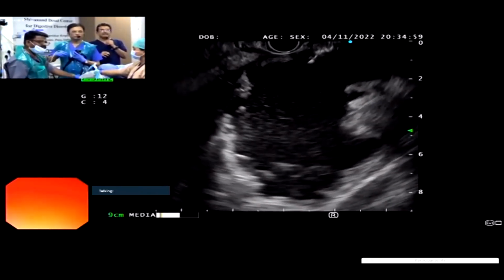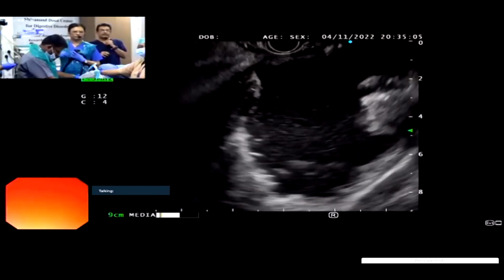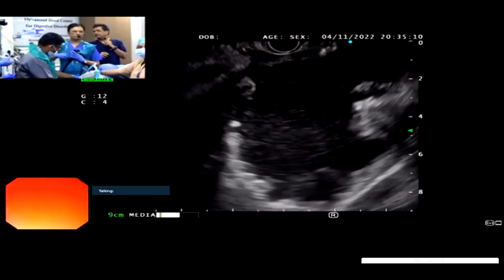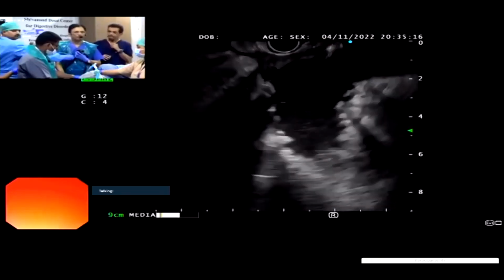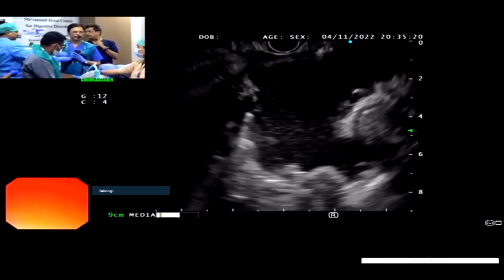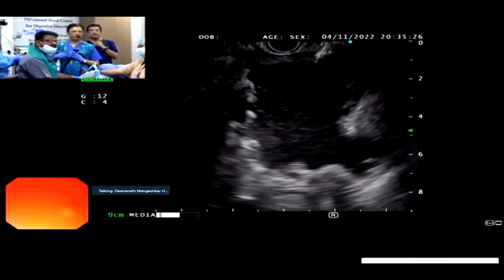Now you will see that Rajendra will dilate with a balloon. So I am using a hurricane balloon. He will use a hurricane balloon and he will dilate. All the time I'm going to maintain the wire position. Okay, now you dilate. Inflate the balloon.